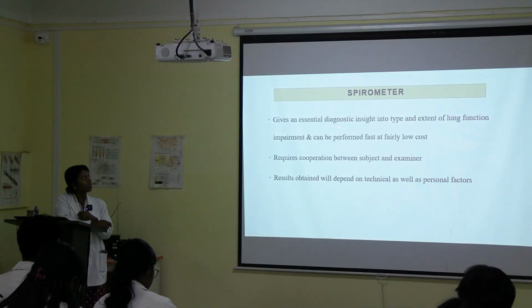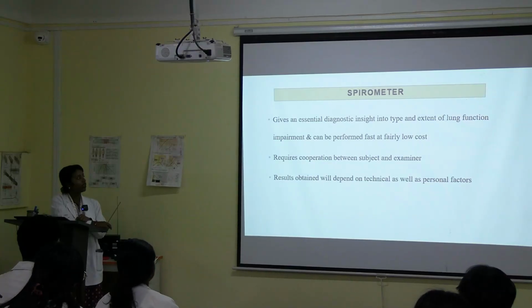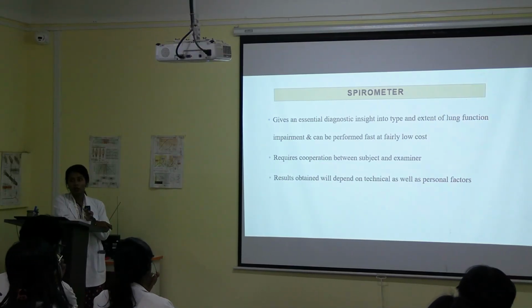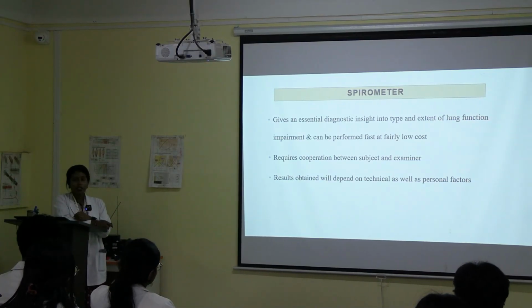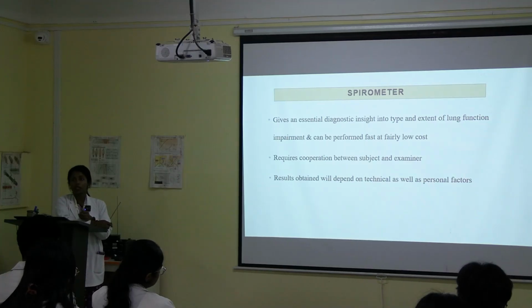So it gives an essential diagnostic insight into the type and extent of lung function impairment, and it can be performed fast, it is very low cost, and very easy to do. But it requires cooperation. The person has to be cooperative. He has to follow your instruction.